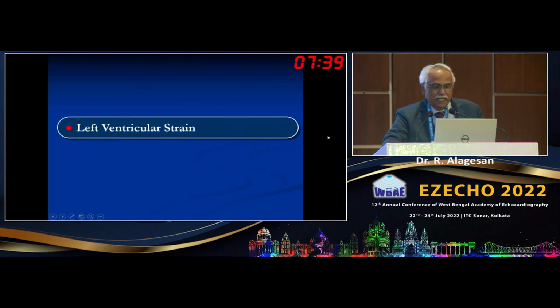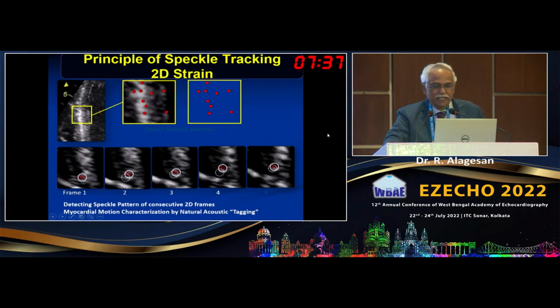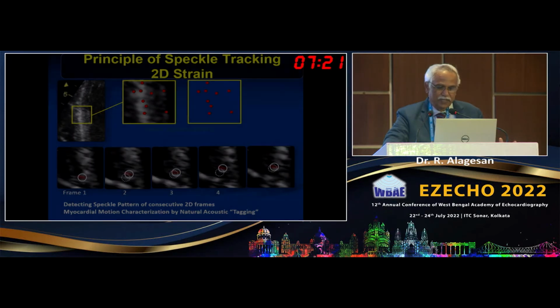Okay, left ventricular strain. Again, Dr. J.C. Mohan is going to talk next on left ventricular strain. We use the two-dimensional echocardiographic method, which is the most popular one, and he will describe how to get the left ventricular longitudinal strain.